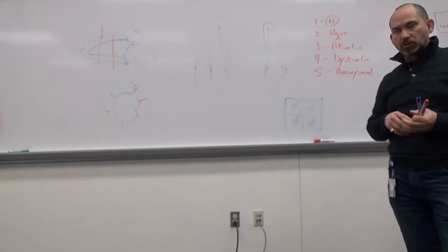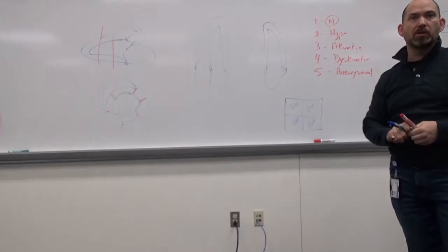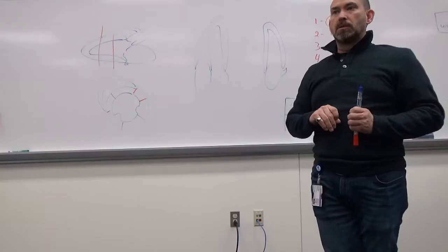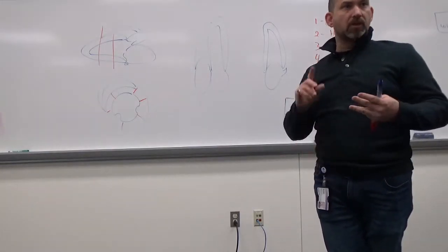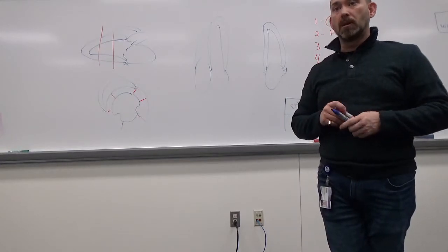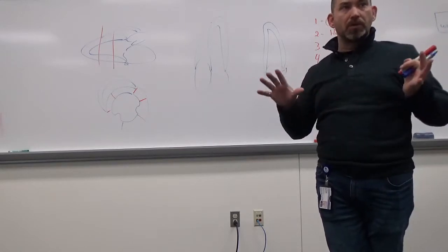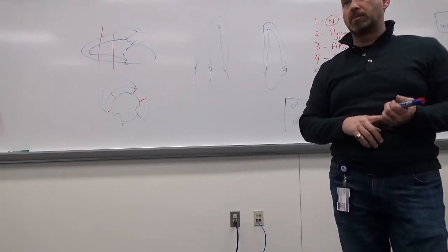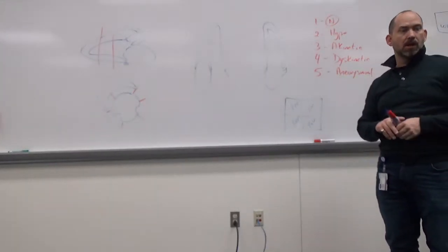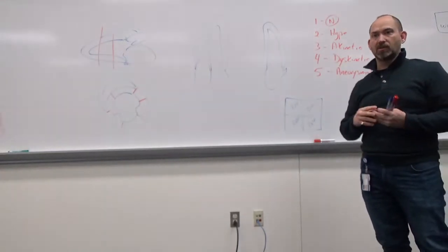So thinking back to EKG when we talked about stress exams, what physiological things do you expect to see the patient experience during stress, in a normal situation? So faster heart rate, bigger contractility, all that stuff that we talked about on the heart, but what about just physiologically on the patient? Respirations. Yep, so they're going to be breathing faster, they're going to be sweating. So all those are normal things. They should not be nauseated, they should not feel like they have to vomit. They should not have syncope. What's syncope? Dizziness. Okay, so the passing out or feeling faint, that's not normal.